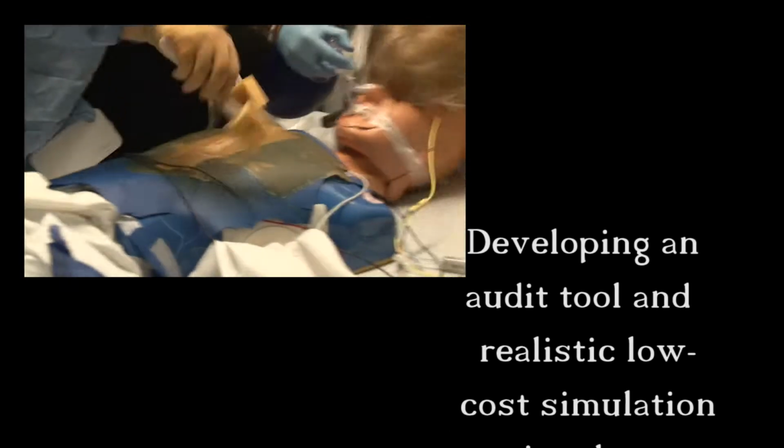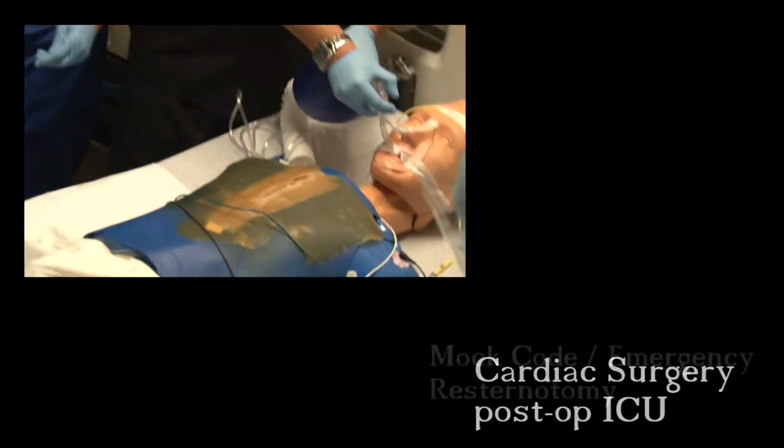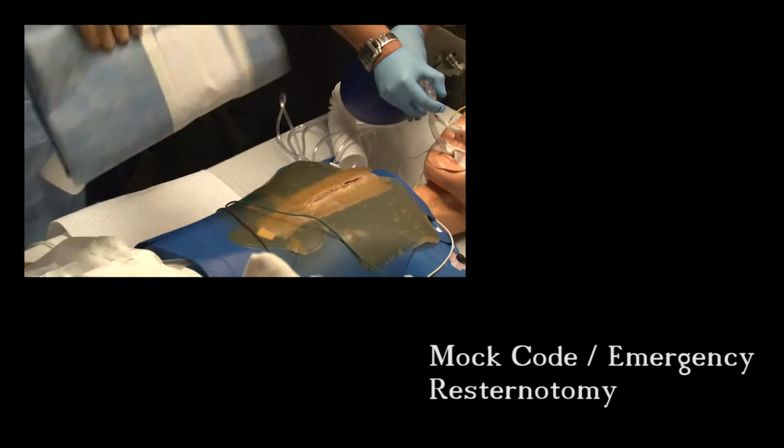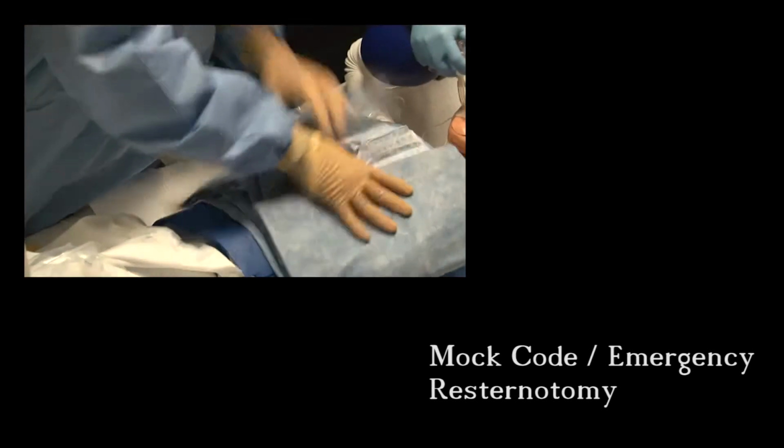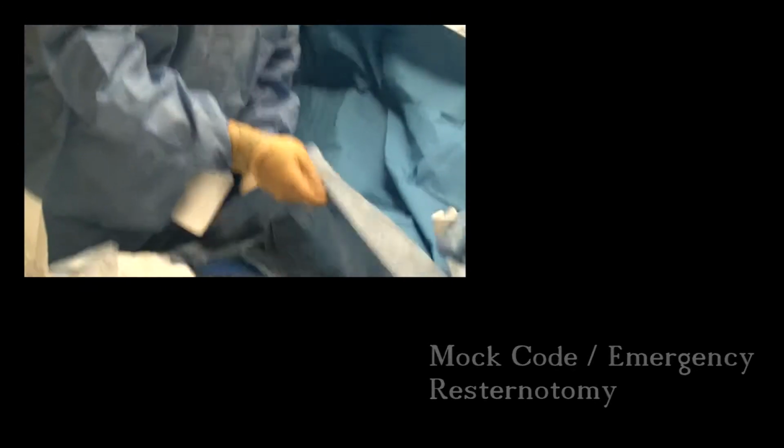Give me a drape, please. Got it. Can I get some gloves, please? Get her a glove and a gown. 6.5, 7. 6.5, down. Either one. Are you bagging the patient? Yeah. Do you have a pulse ox lead or no? Nothing.